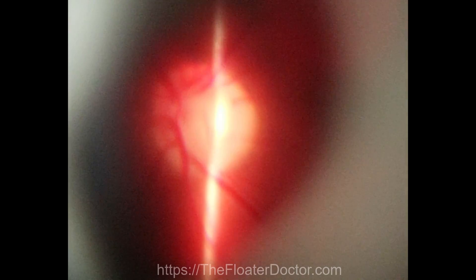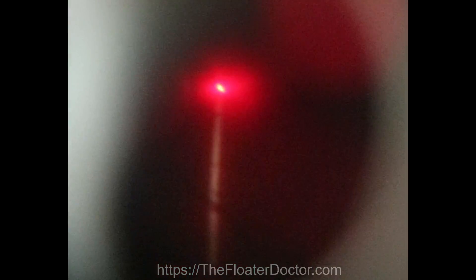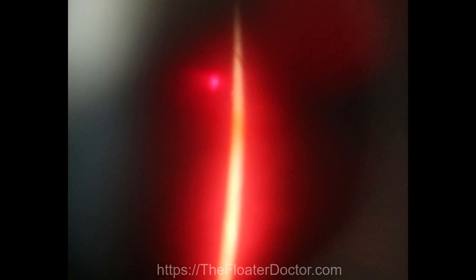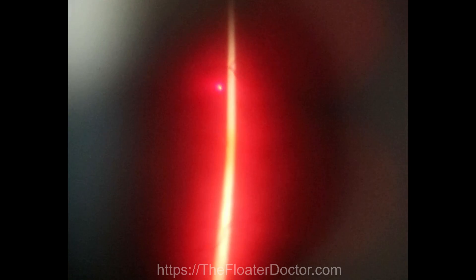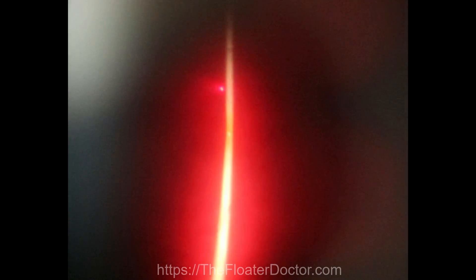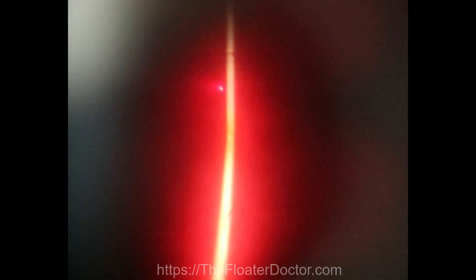Swinging back to the optic nerve for reference — its diameter is about one and a half millimeters. Coming back over here, these little densities are very microscopic. Visually taking that one-and-a-half millimeter reference and flipping it toward me, these things are literally sitting on top of the retina — probably a tenth of a millimeter away anteroposteriorly, and positionally about half a millimeter from directly overlying the macula. And there's more over here — a little cluster of additional material.